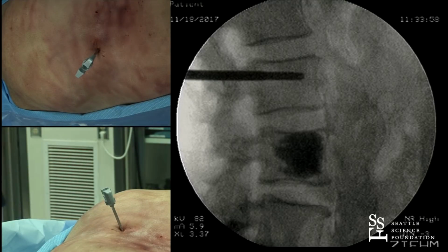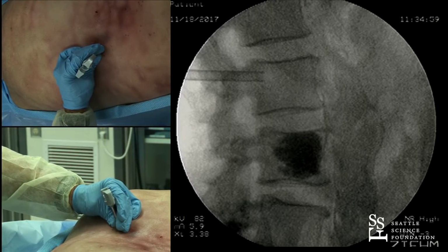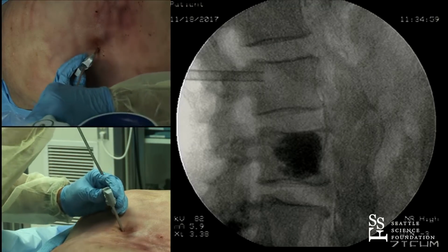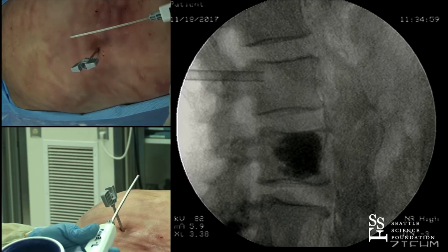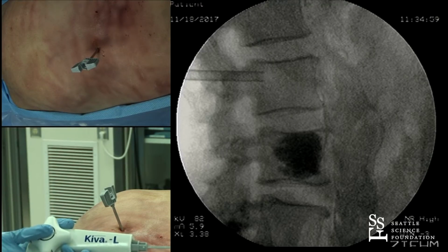So look at the internal part, and focus on the lateral. The inner stylet on this was quite a bit longer, and we left just 5 millimeters inside the vertebral body, 5 millimeters from the distal tip. And the Kiva device, the coil goes forward with the blue knob. The implant goes forward with the other one. And once the implant is deployed, it doesn't come back.